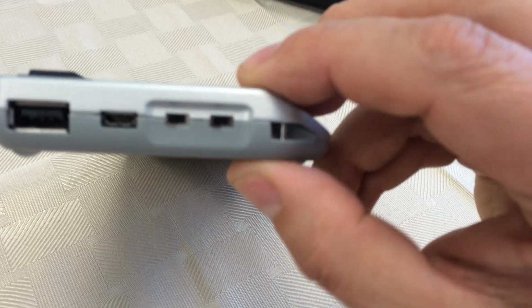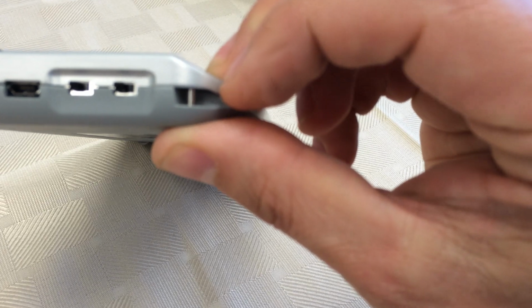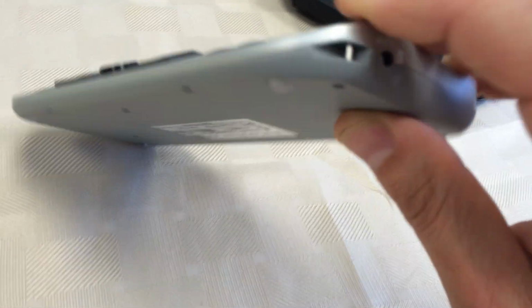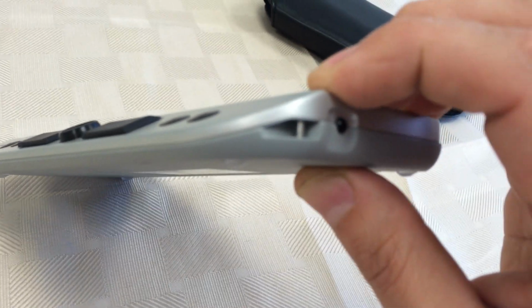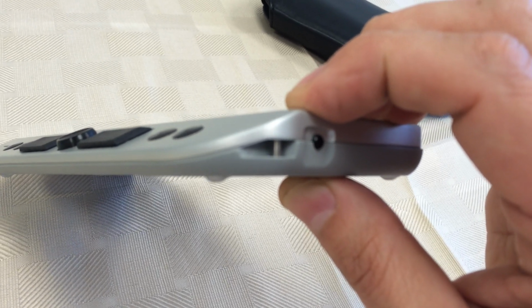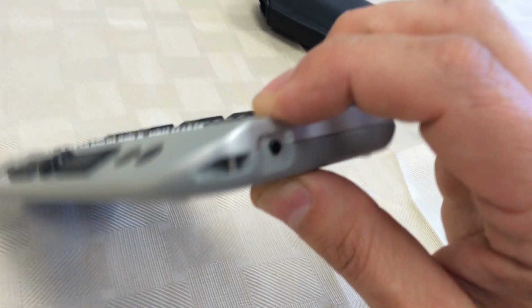And then the 5th thing, just to show you here, is in the left front corner of the VarioUltra. And in fact, there's another one in the right front corner of the device, are 2 anchor points. This is where we attach the carry strap that is provided with VarioUltra for when you're carrying it around.